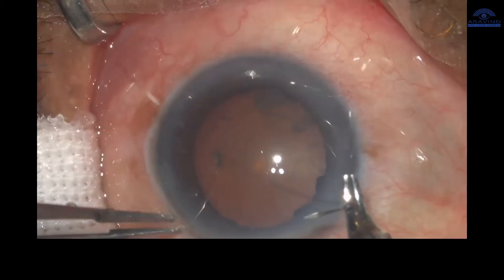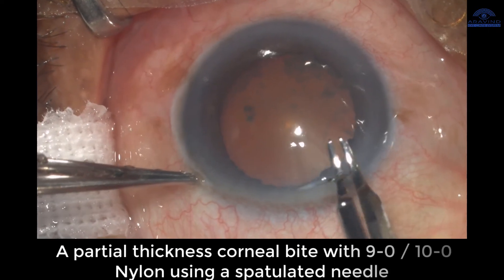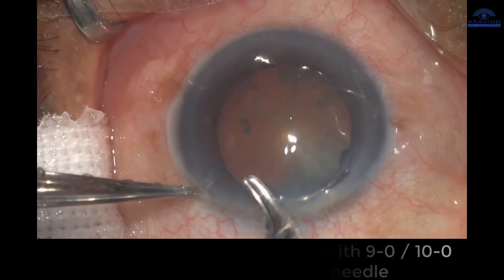We can place a corneal traction suture. A partial thickness corneal bite with 9-0 or 10-0 nylon using a spatulated needle can be used to place the corneal traction suture.